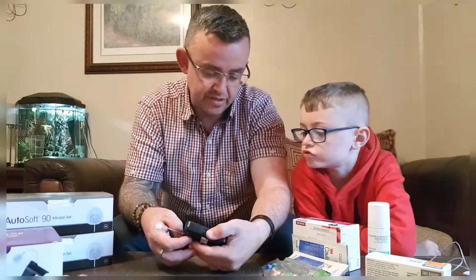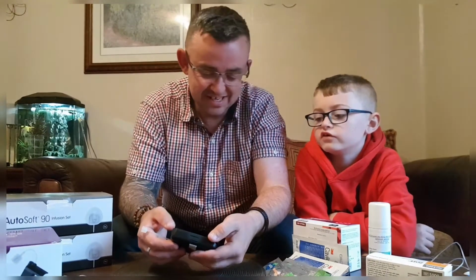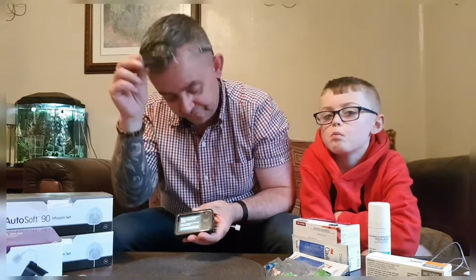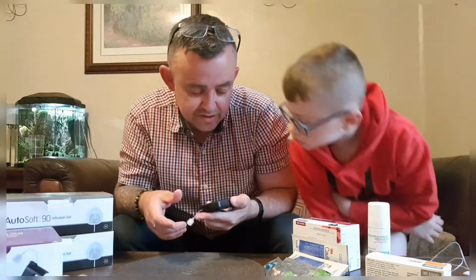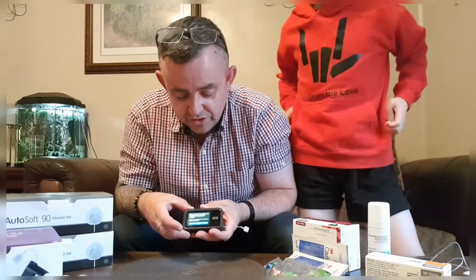This just takes a few minutes. We're at about 40%. Is that done? 70%. So make sure the set is disconnected from your body and securely connect the tubing to your cartridge.